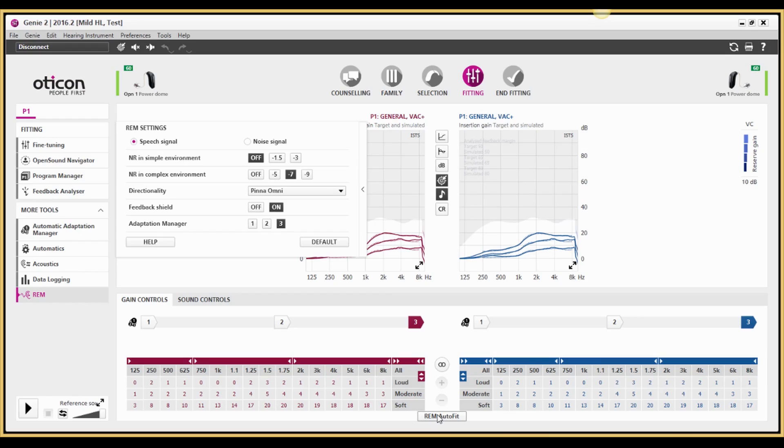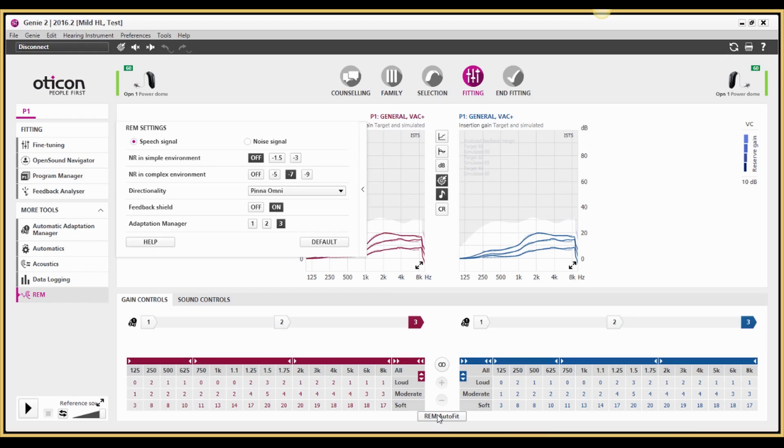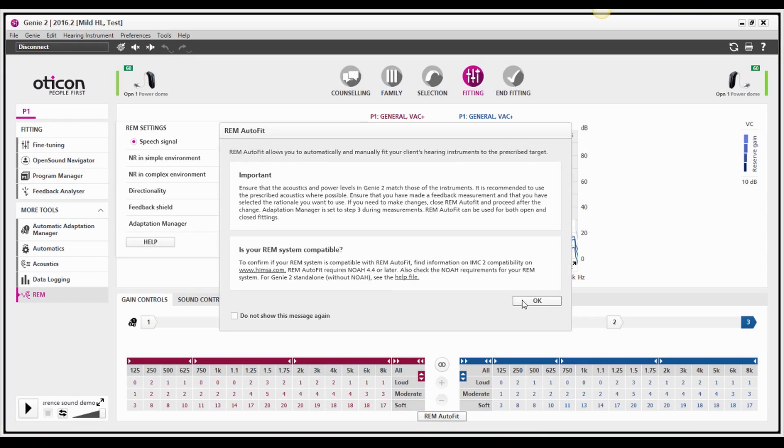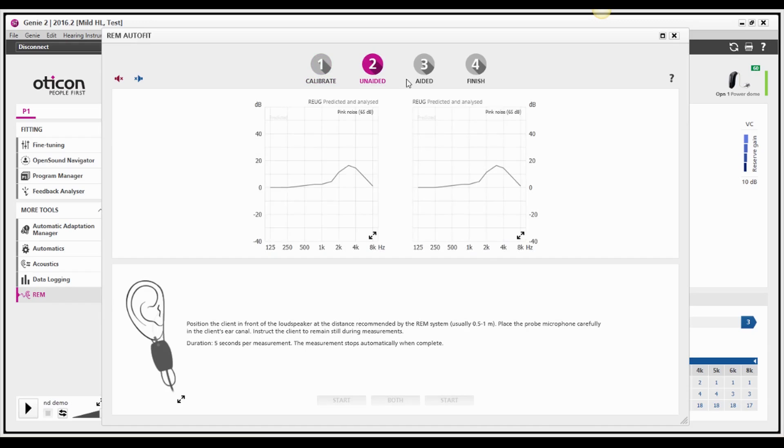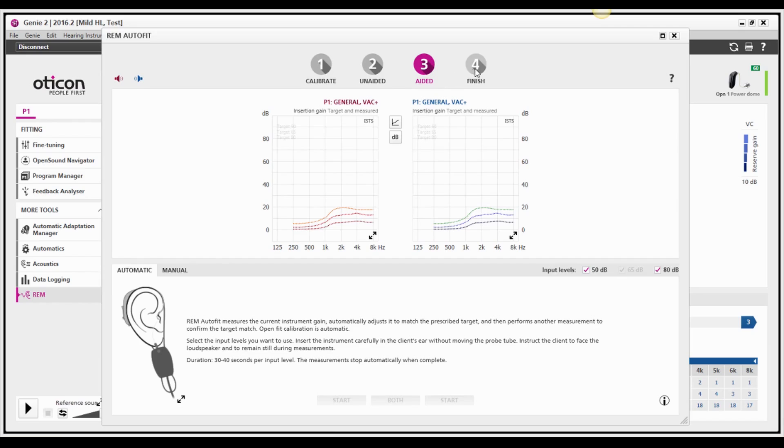Let me show you some highlights of the tool. There is no need to run the fitting software and REM software in parallel. You simply select the tool in Genie — no need to flick between screens. REM AutoFit communicates with the REM system to run tube calibration and unaided and aided measurements, all within the fitting software.